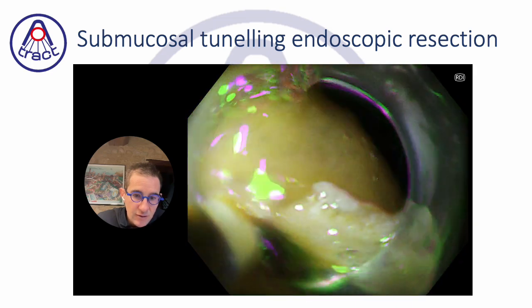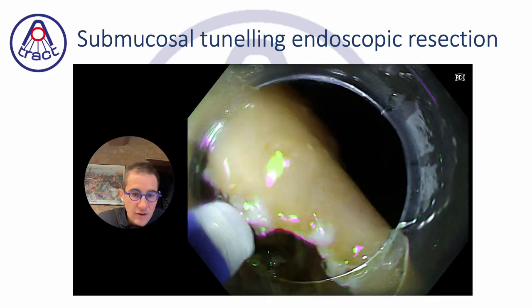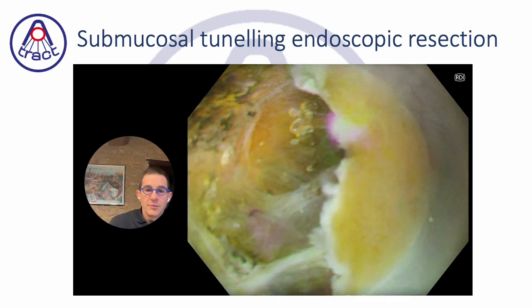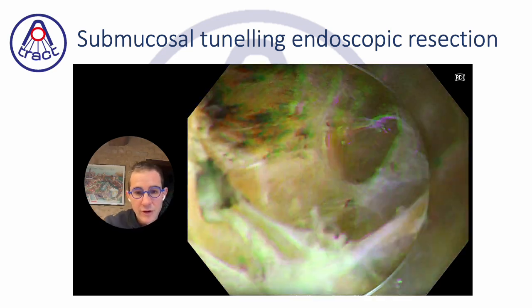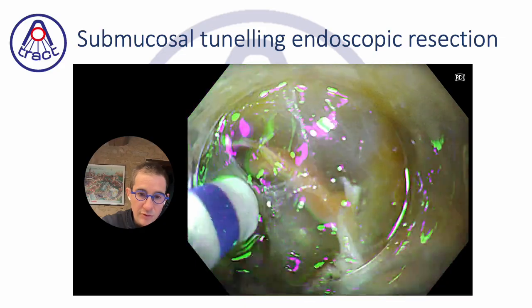And finally, we could obtain hemostasis a little blindly in the angle, thanks to the fact that we saw it by going a little deeper in the channel. So it's probably an important point.